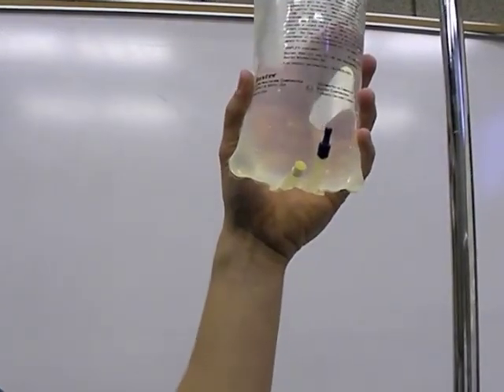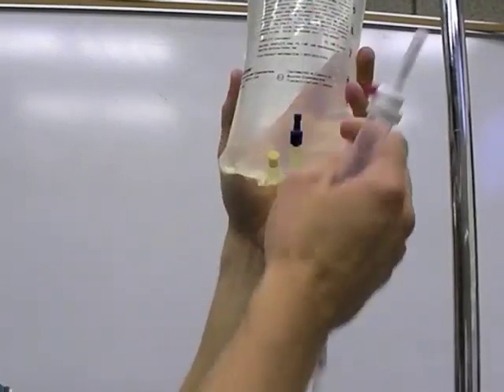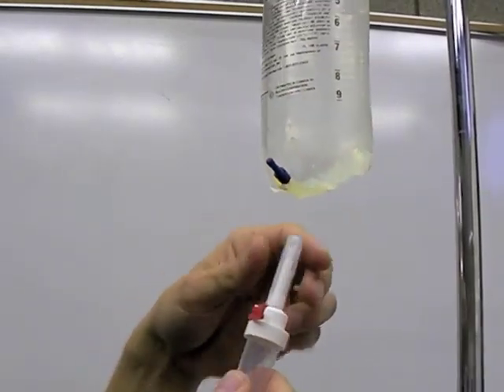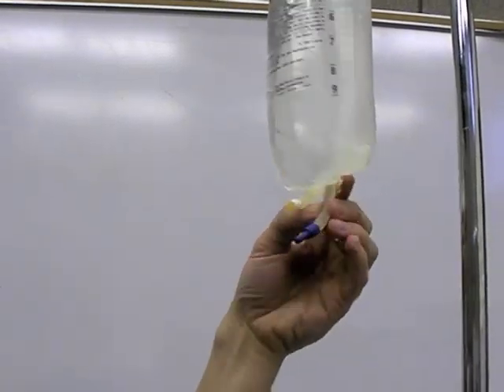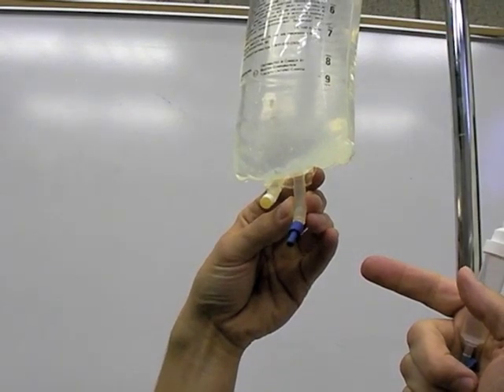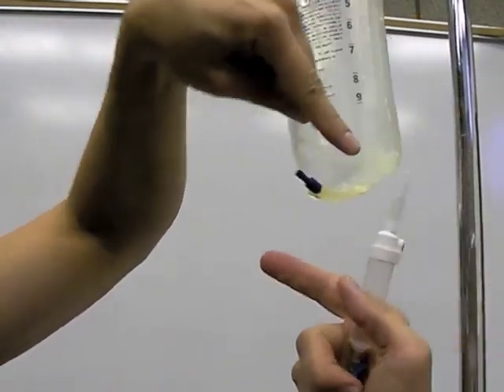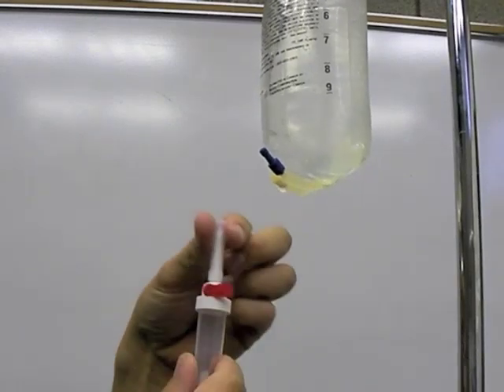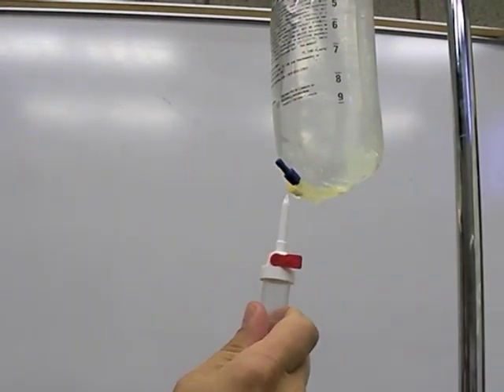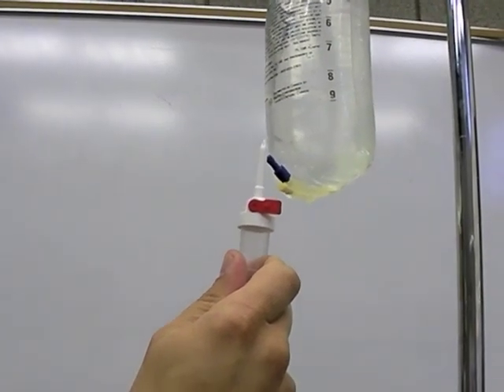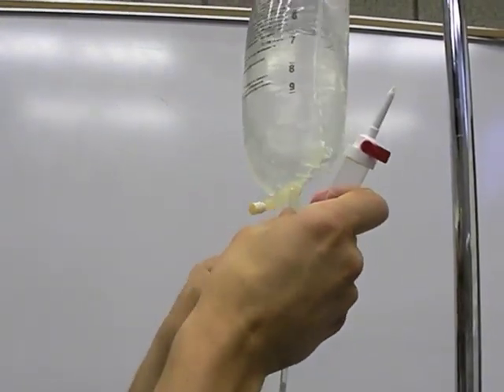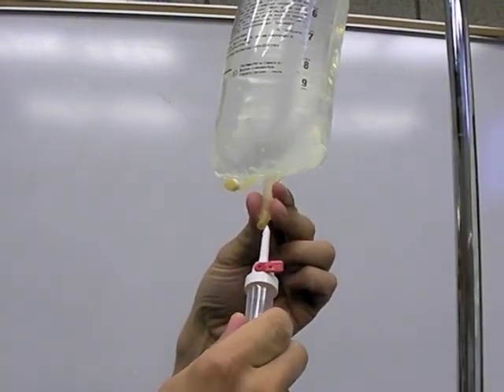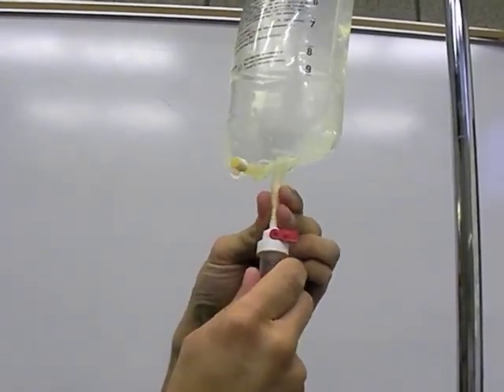Now we will spike the bag. On the bottom of this IV bag are insertion sites, one with a removable plug and one for needle insertion. This is our removable plug. On the top of the administration set is a sterile cap over the spike. Remove the cap making sure that it maintains sterility by not touching the spike. Remove the blue plug from the bottom of the bag, making sure not to touch the area the plug was just removed from. With your dominant hand, insert the spike into the solution bag completely covering the spike.